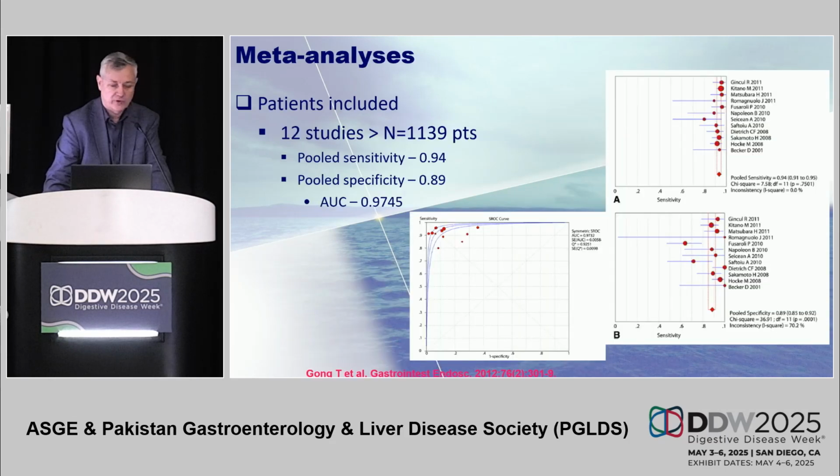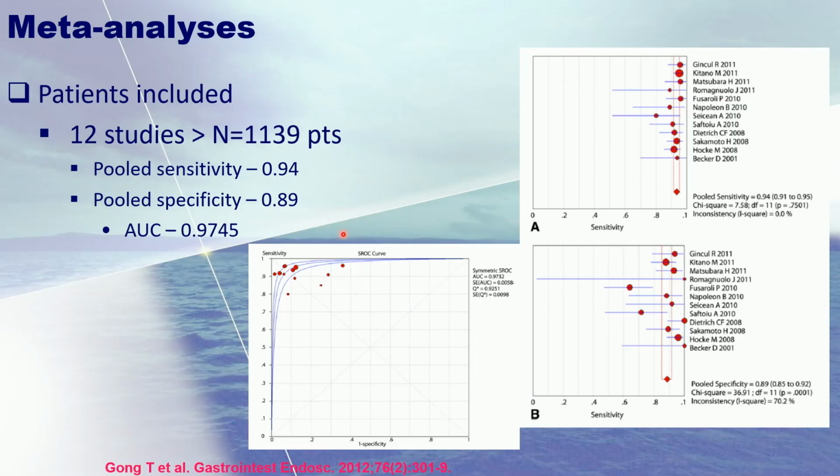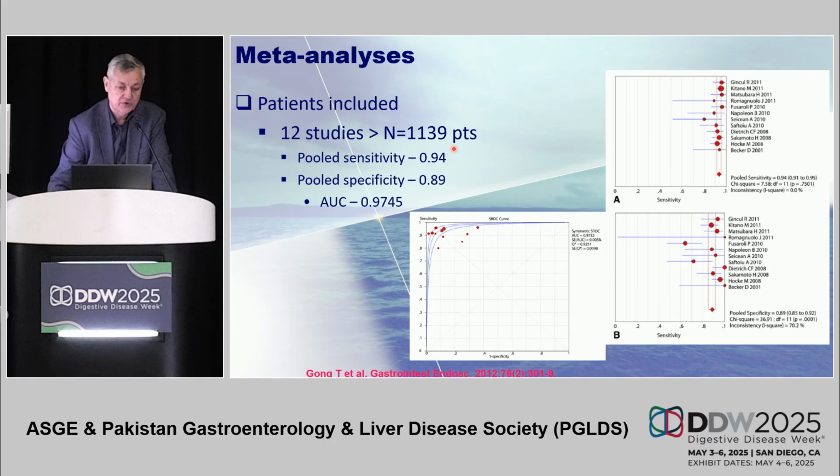If you look at the data for diagnosis, it works better than elastography. The sensitivity and specificity are higher than 90%, but still it would be difficult to convince especially the surgeons in multidisciplinary meetings based only on elastography and contrast if the final biopsy is negative. So we still do all of them in a row in the same examination. It doesn't take too much time, so you can do both elastography and contrast enhancement. It takes only 2 minutes, and then we do a final biopsy.